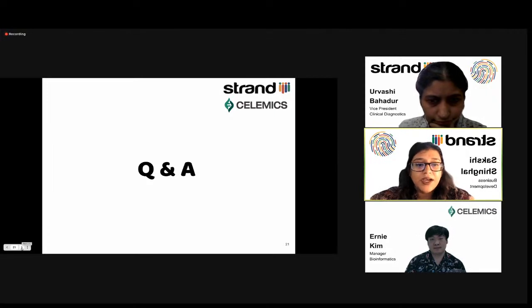In the meantime, Christine Yan asks, how do you ascertain or verify that the variant identified in the VCF is a true observation and not a sequencing error, a bioinformatics analysis error, or bias?